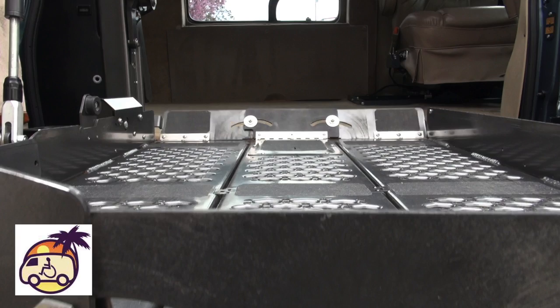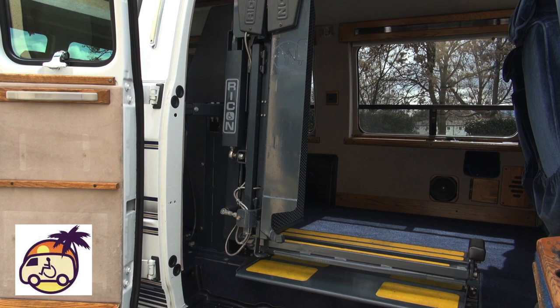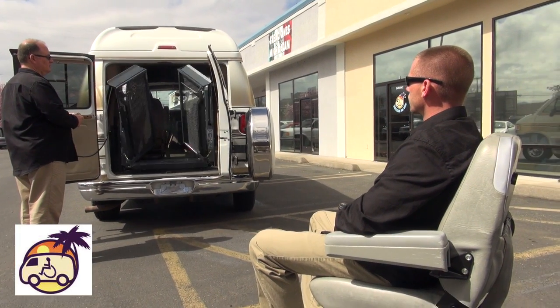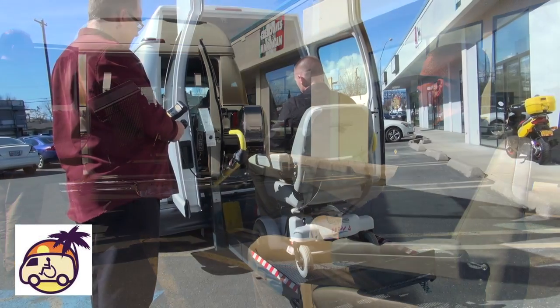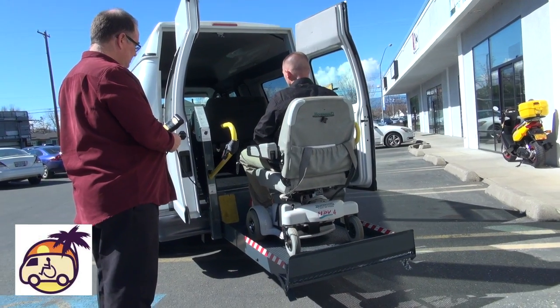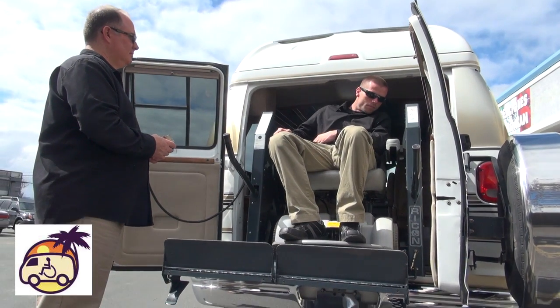As far as the weight capacities go, the lifts with a single arm or post and a folding platform usually have a 600-pound capacity, and the lifts with two arms and a folding platform are usually rated at 700 pounds. And lifts with two arms or posts and a solid platform are usually rated at 800 pounds. These are the general facts about lifts.